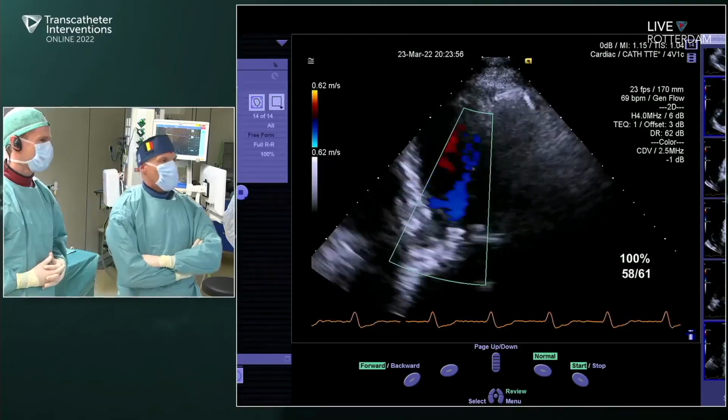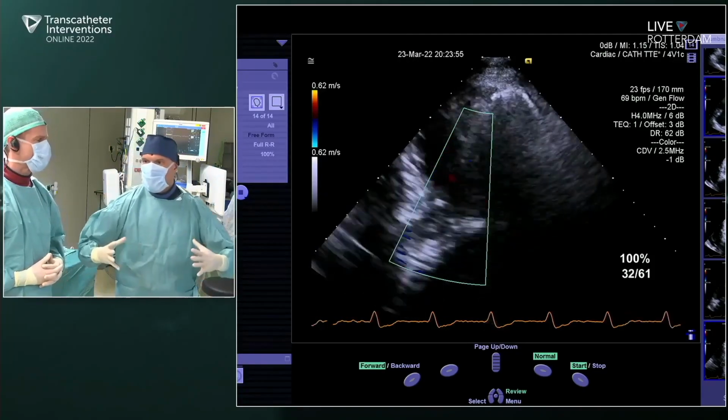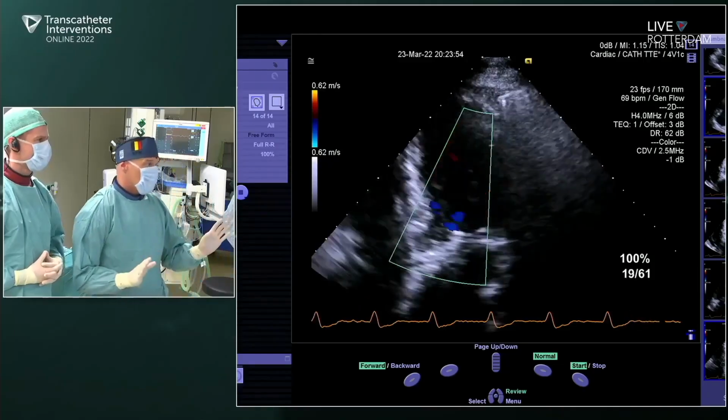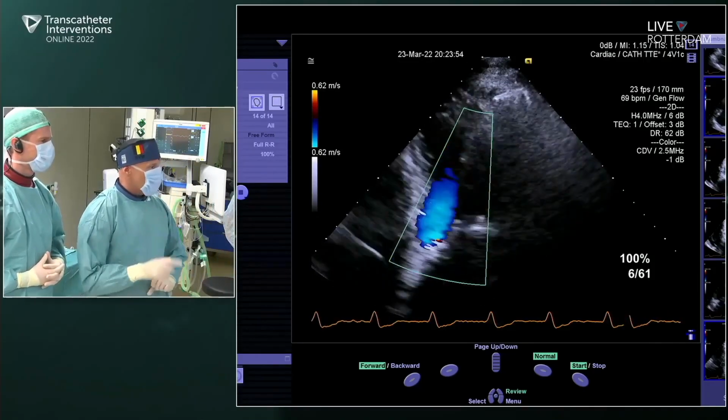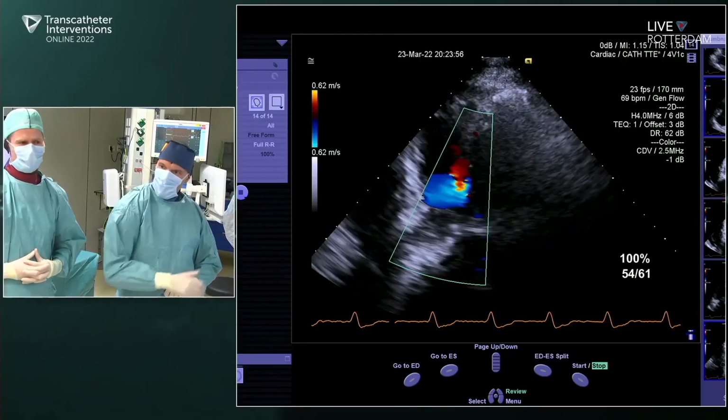Yeah. So the seal does its work. There's also the nitinol that keeps on expanding. So this is, I think, a very nice result. And what also was of interest, and Quinten, maybe you can show the introduction of the FlexNav.